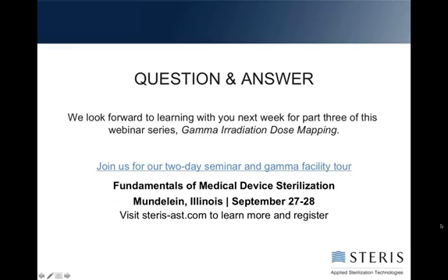Should there be a problem with one, it doesn't affect both of them. But to simplify the validation, many times they are tested together. But that means if there's a problem with either one, both of them fail. So you can add them together to test them, or you can test them as 2 separate products and 2 separate validations.